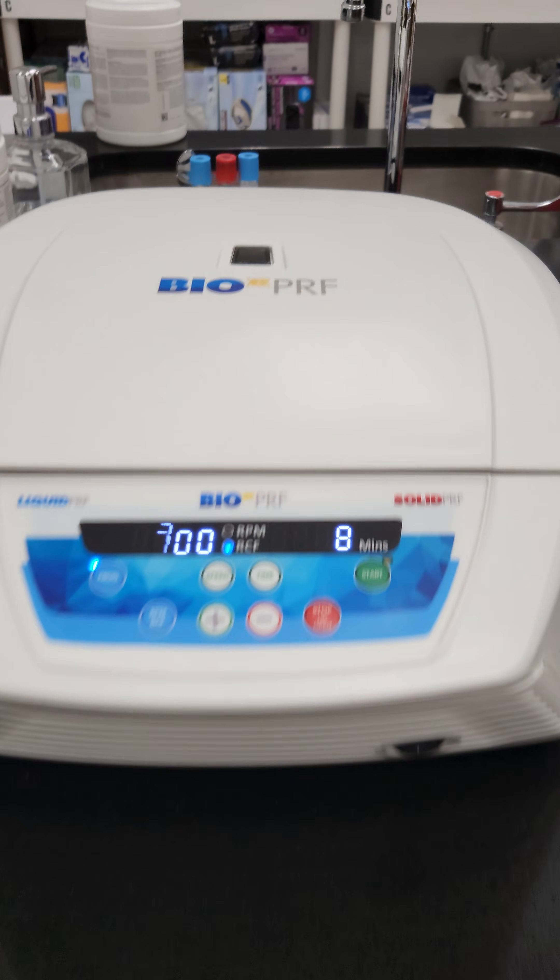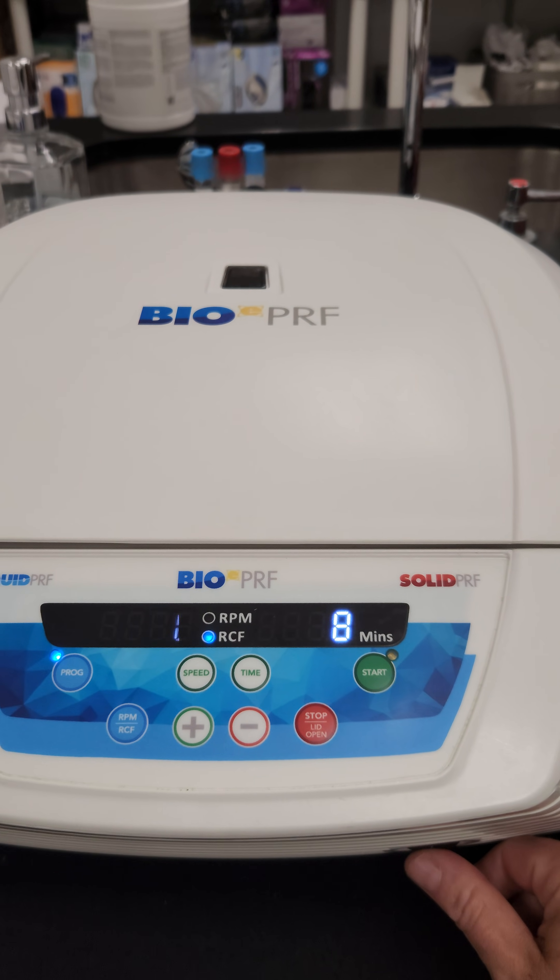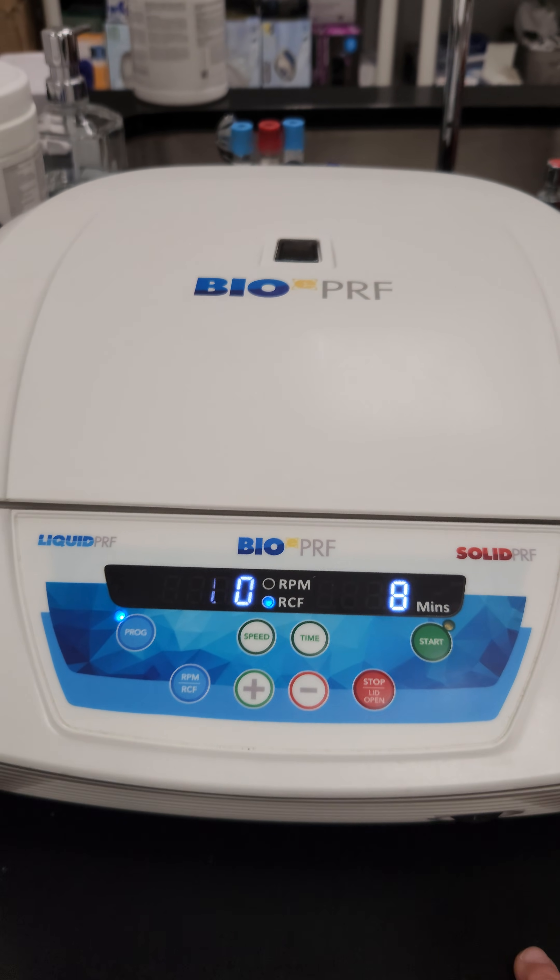Just make sure that before you turn the centrifuge off, it is no longer spinning.